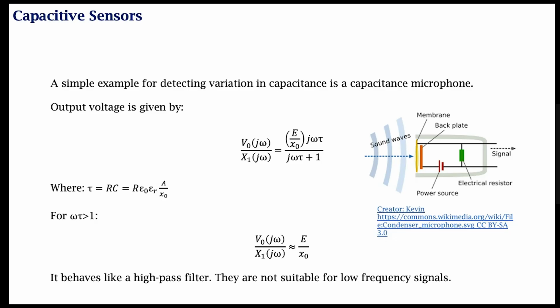That is the heart sound. This technique, this method of using heart sounds, or sounds in the lung, to diagnose heart condition is also called phonocardiography. Please do check what it is. Using a microphone, you measure heart sounds.